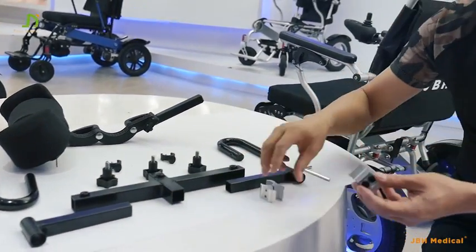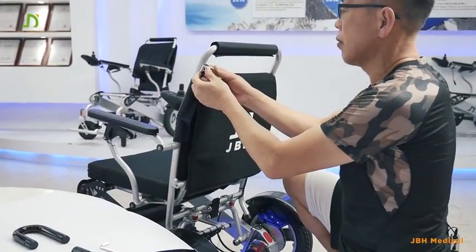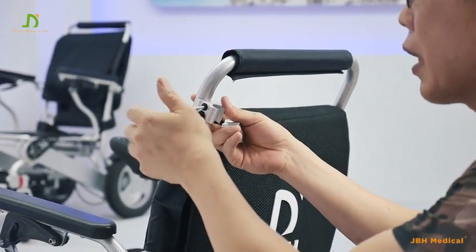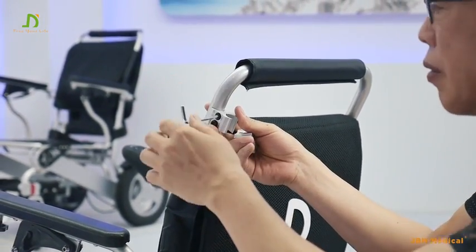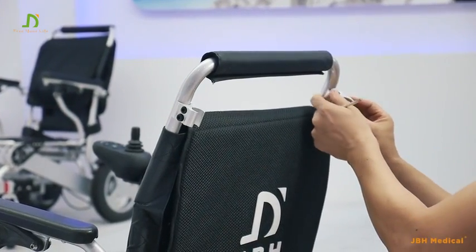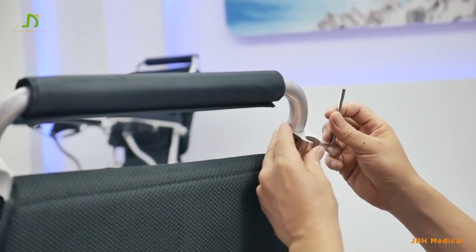First of all, we have two AV clippers here. Simply fix them on the frame — slightly, not fully fastened. The other one goes on the other side. At this point it should still be moveable.